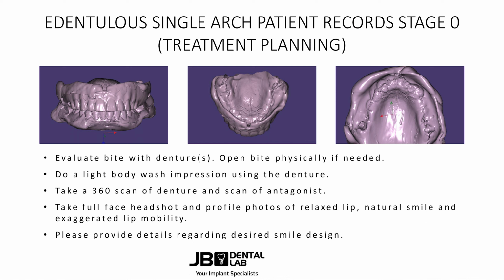Once this scan is completed, you'll put the denture back in the mouth with the wash impression, and it's time to take full face photos from the portrait and the profile. We want to see the patient with a relaxed lip, a natural smile, and an exaggerated smile. And please provide any details of changes or smile designs that the patient has. We'll go over and look at these photos in a later slide.